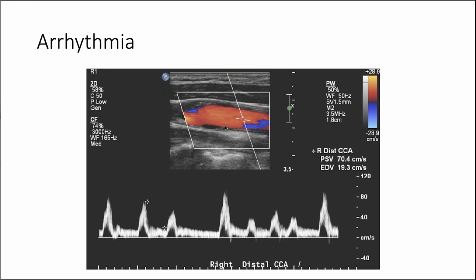And in this particular case, I think you want to try to avoid the ejection that happens after a long delay. This is a situation where generally ventricular filling is good or better than usual. And you want to avoid ones when the interval between the pulses or the pulse period is relatively short, because there's going to be a small ejection here because of lower filling of the ventricle. Probably the one selected by the sonographer here is the best one. In this particular case, all of the peak velocities are normal.